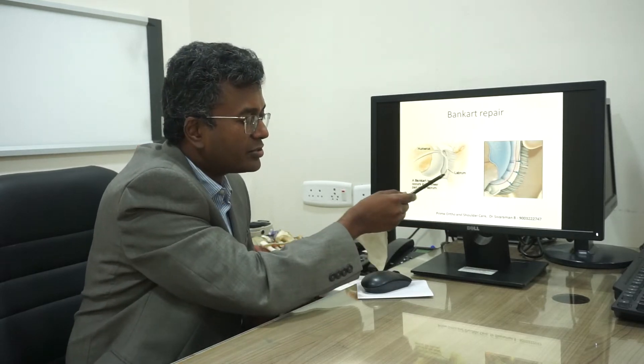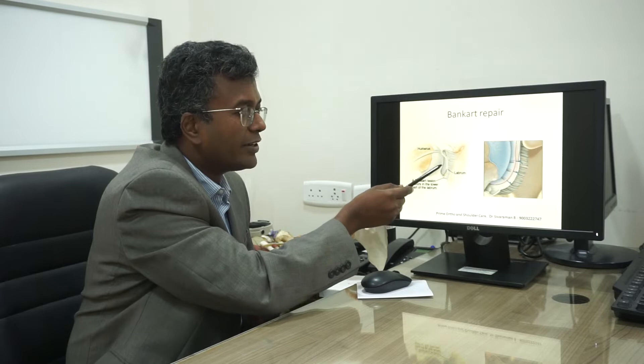This is called the Bankart repair, addressing the Bankart lesion — a labral tear — which we reattach with anchors. We attach this tissue back in place with the help of anchors and sutures, which is called the Bankart repair.